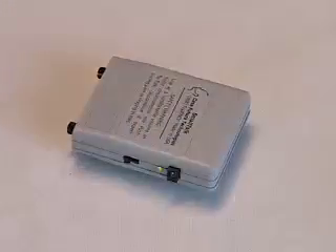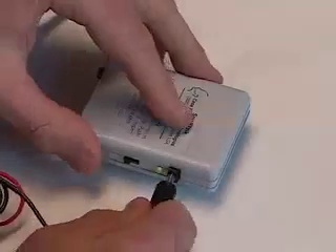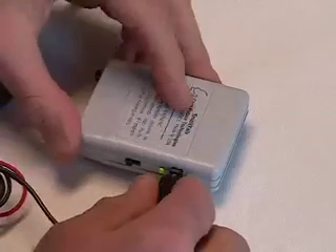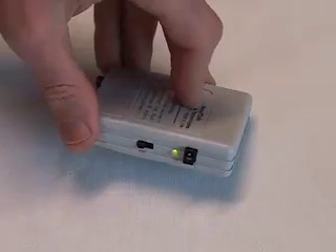The Smalltalk has a rechargeable battery. Plug in the charger to recharge the battery. The light changes from green to red to indicate that the battery is low.